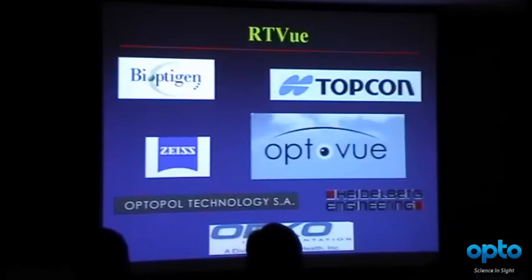So what about these multiple systems? How come there was only one time domain machine, but there are multiple spectral domain machines?